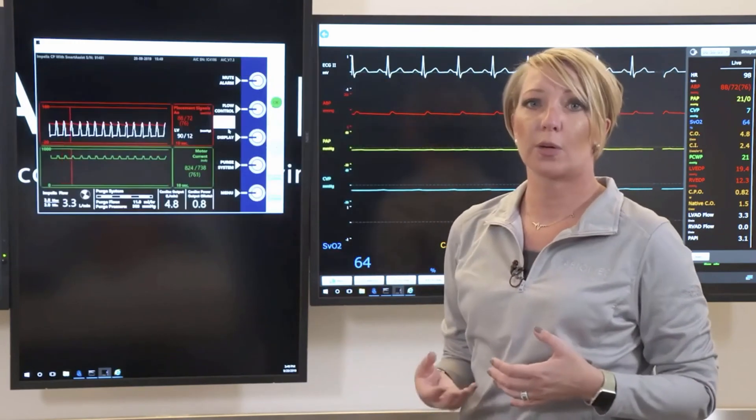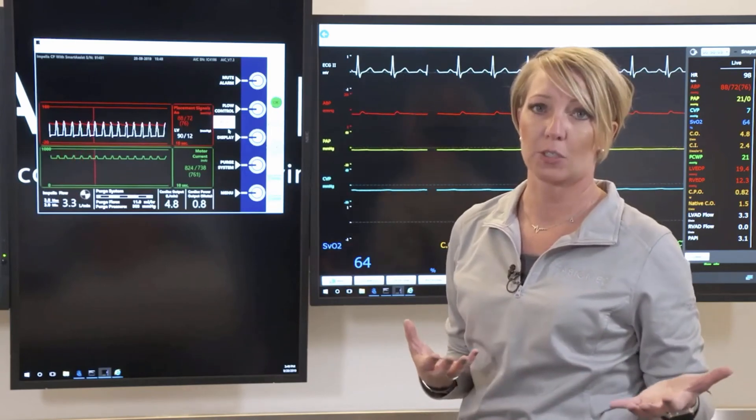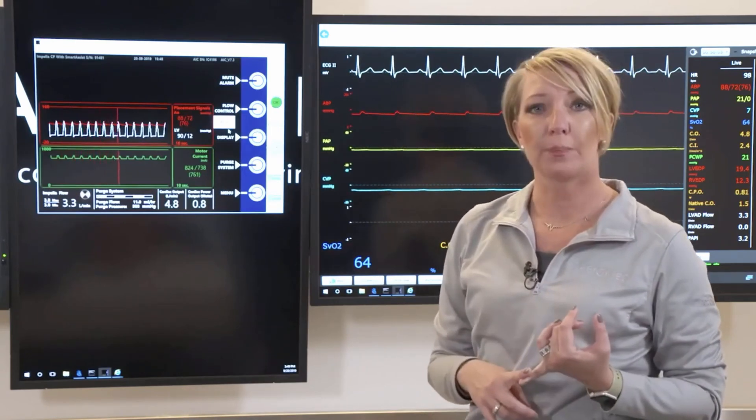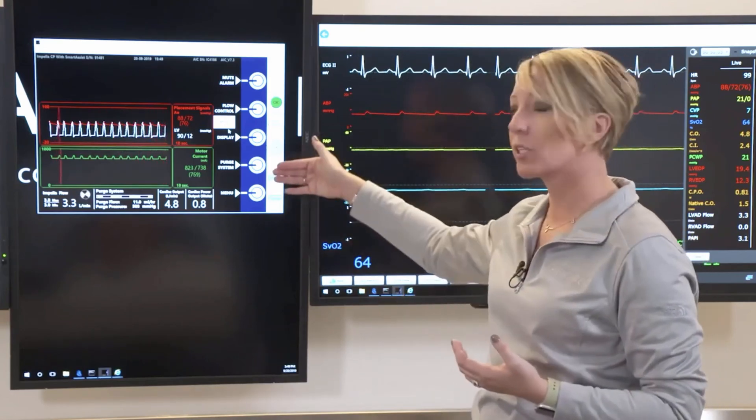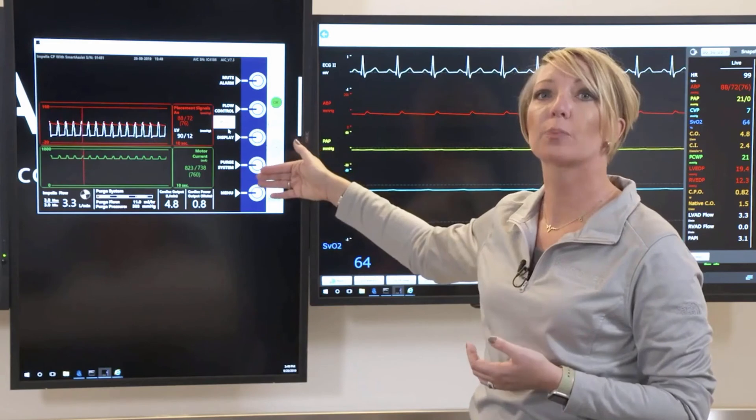There are going to be times when you need to take an action on that purge solution. You may need to change the bag or change the cassette. Anytime you want to go in and take an action on that purge, you're going to go into purge system.